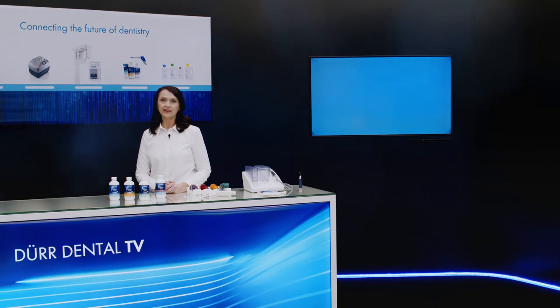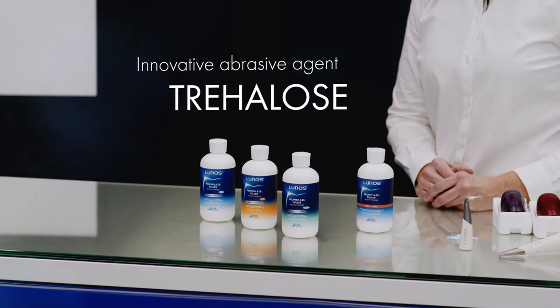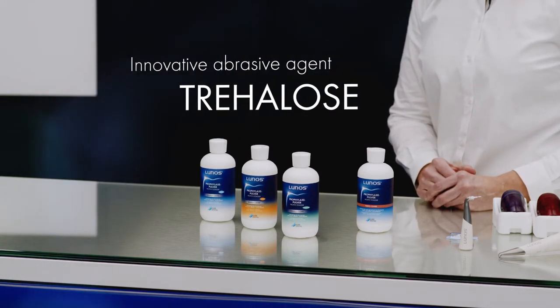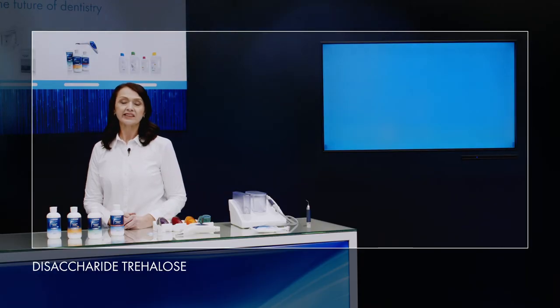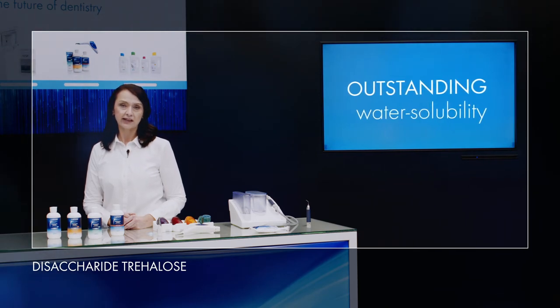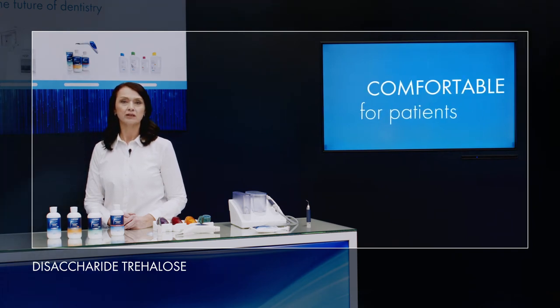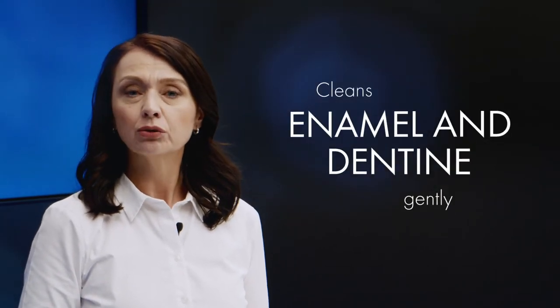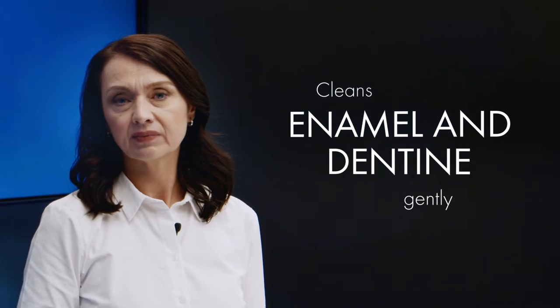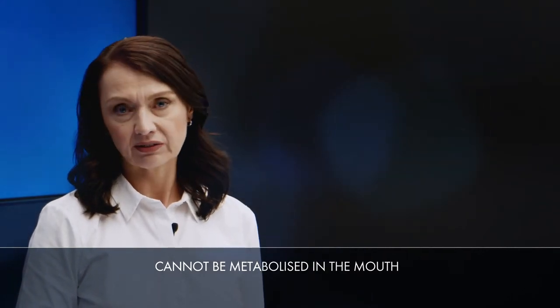Various myLunos prophy powders are available for use with the myLunos powder jet unit. All Lunos prophy powders are based on Trehalose, an innovative abrasive agent. Trehalose is a disaccharide that is incredibly water-soluble. This outstanding property protects the suction unit in particular and leaves no unpleasant powder residue in the patient's mouth. Trehalose provides a quick and thorough clean, but is also kind to enamel and dentine. Trehalose, a naturally occurring sugar, tastes slightly sweet, yet is not cariogenic, as it cannot be metabolized in the mouth.